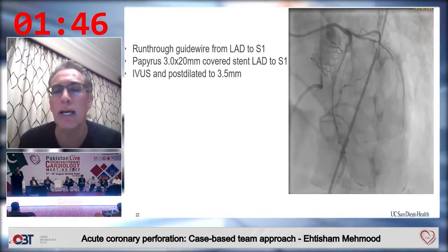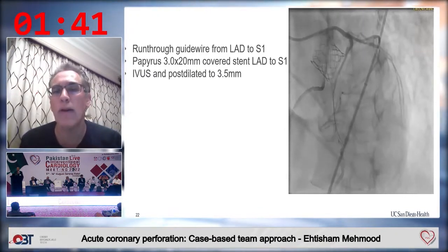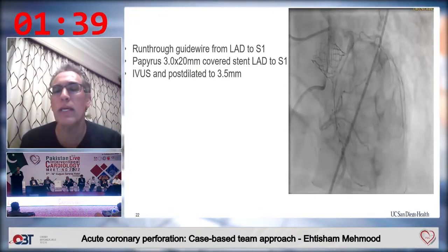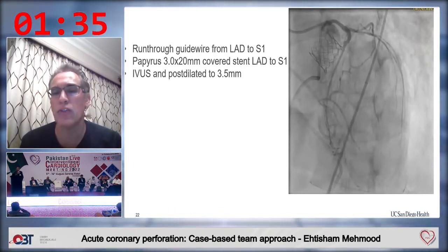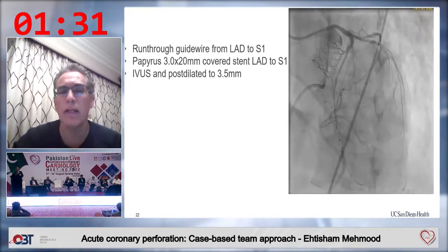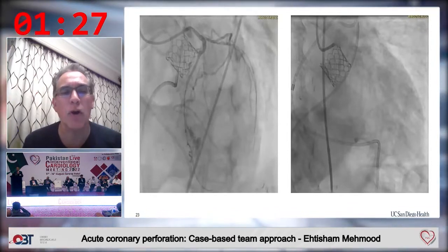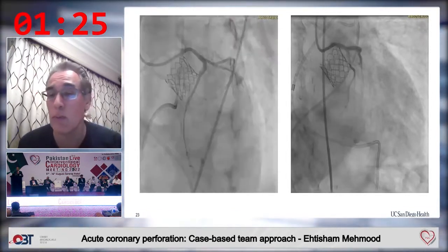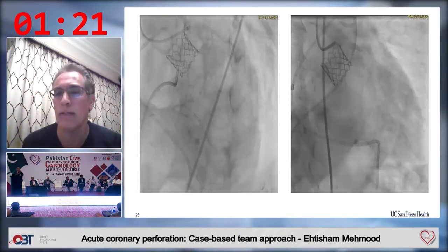So take a look at the very tip of the septal wire. There seems to be a little bit of contrast hang-up and opacification, and that would remain unchanged. Taking more pictures, that now starts to grow. And part of what was going on is that the pericardial drain continued to drain blood.